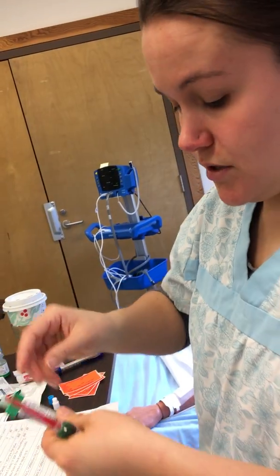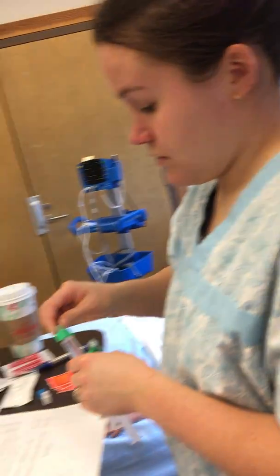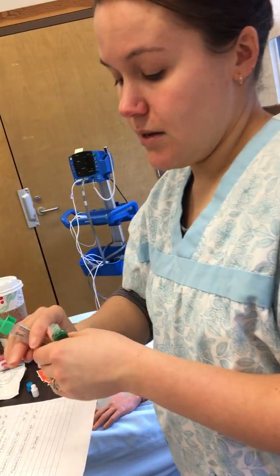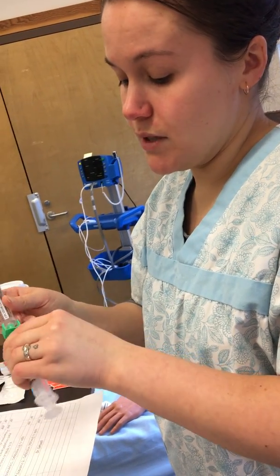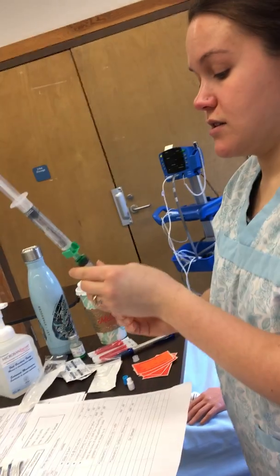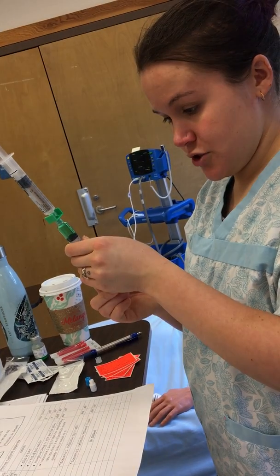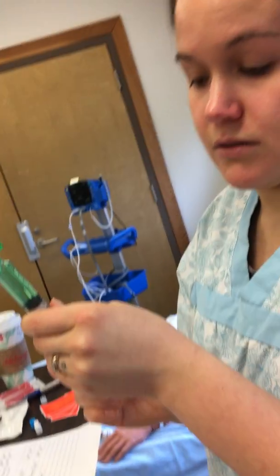And then I'm going to take this needle off, put it in the sharps. So I'm going to have another nurse with me while I do this all, checking the dose, and most importantly, watching the wastage, and we have to sign on a narcotics waste sheet, which I don't have, but just so you know, the thought was there.